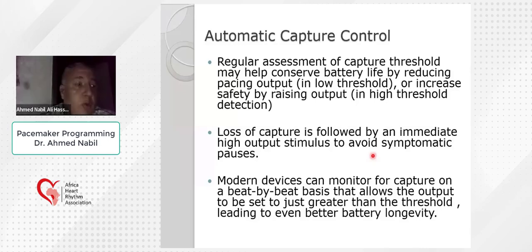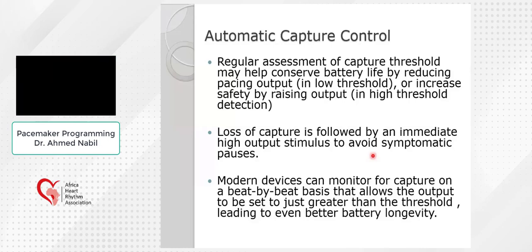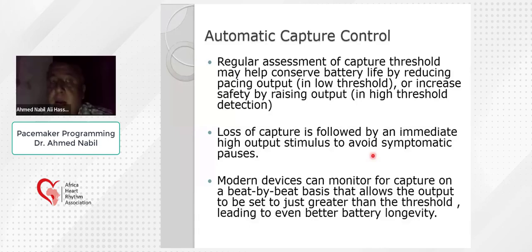Also, we have the automatic capture control that I mentioned earlier. The automatic capture control is a function that is conducted by the device or by the pacemaker. There is a regular assessment of the pacing threshold at a regular interval that is adjusted by the programmer, and the pacemaker itself will adjust the pacing amplitude according to the automatic capture control results.